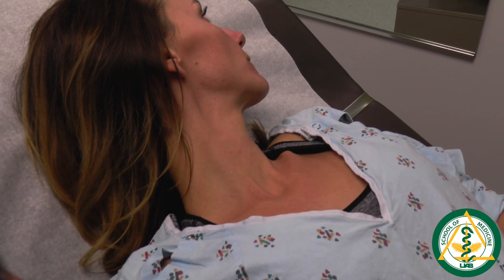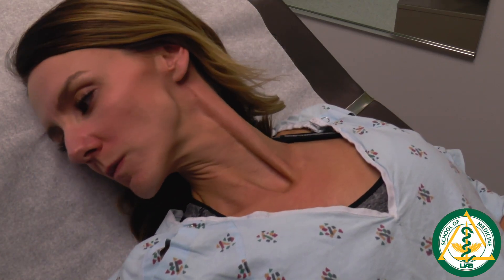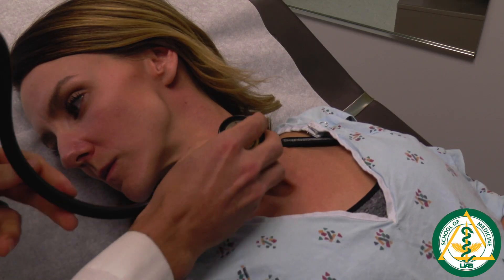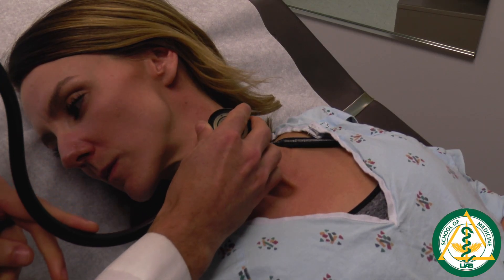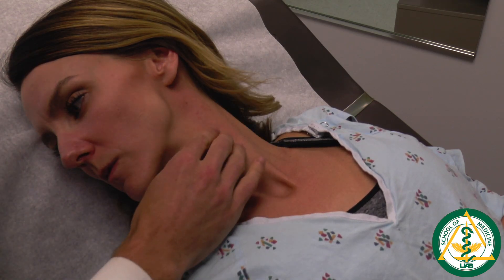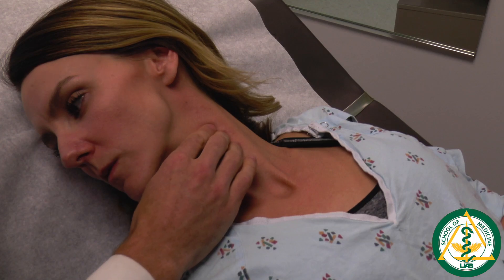We'll repeat the same steps on the other side. First, listen with the bell side of the stethoscope, then palpate in that same area. That completes the neck portion of the cardiovascular exam.